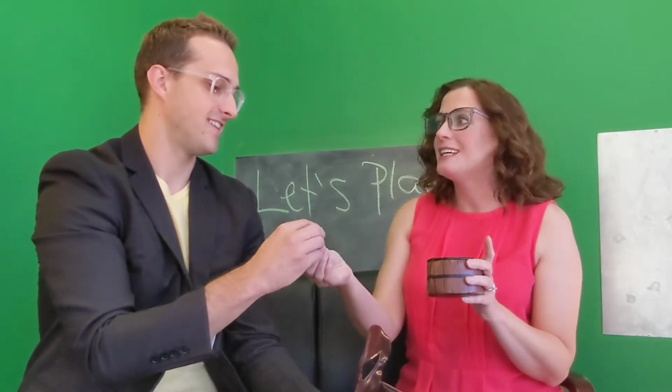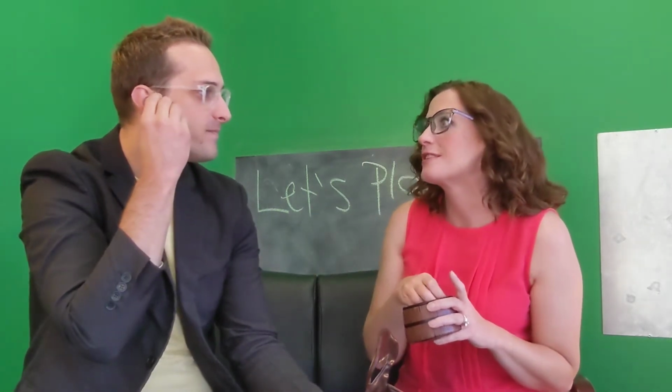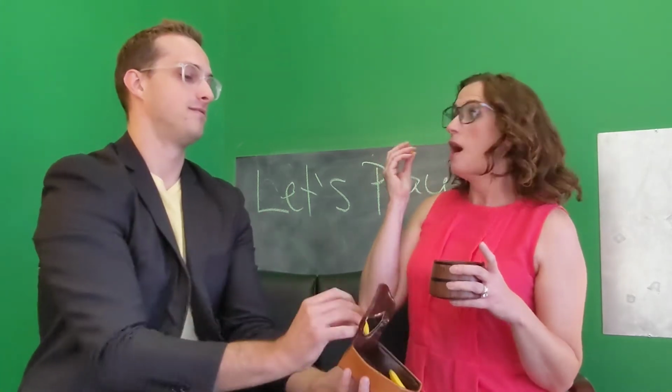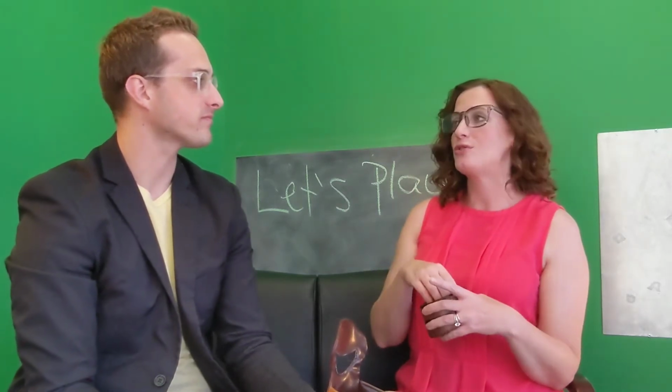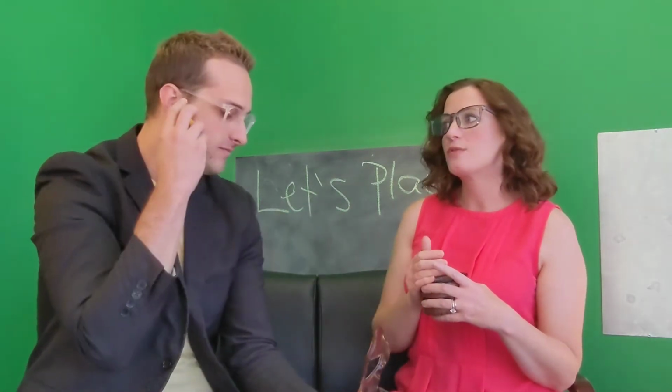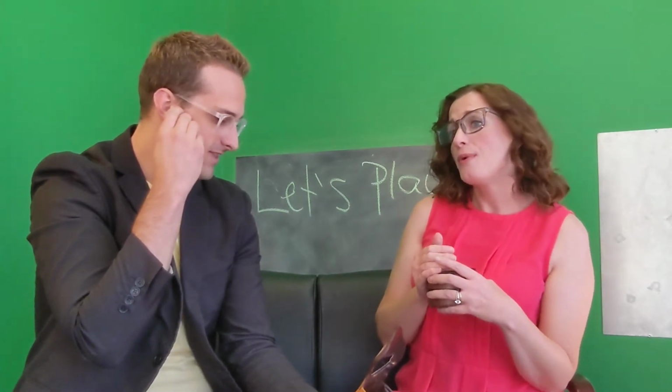Okay, let's try again. Let's see if you can hear it first this time before I can hear it. Wah, wah, wah, wah, wah. Oh, good job! You heard the sound! And then we'll go on to having the child try to do it by themselves. So, okay, listen really closely. Wah, wah, wah, wah, wah.